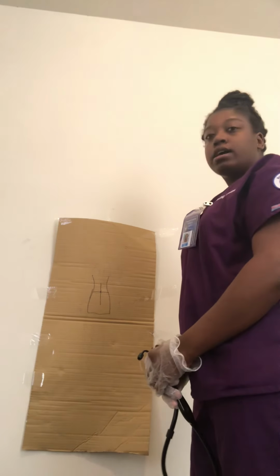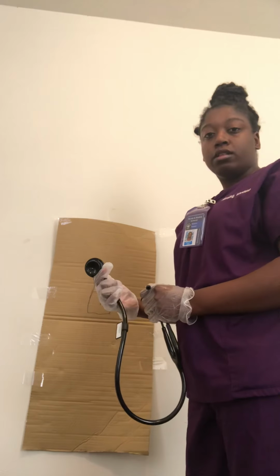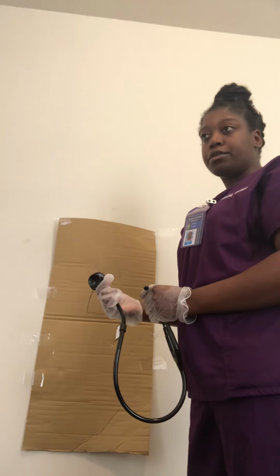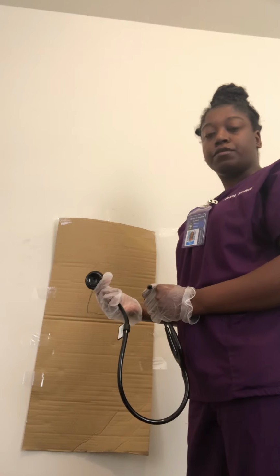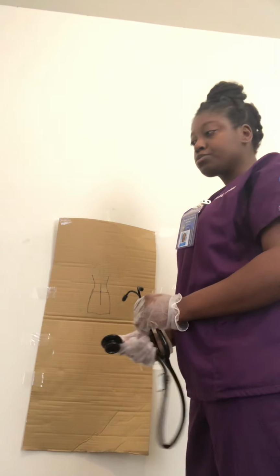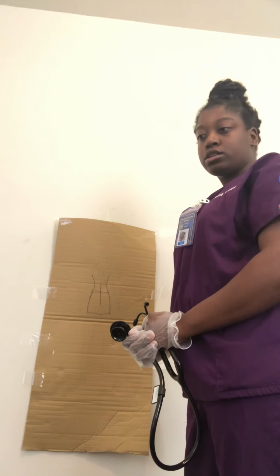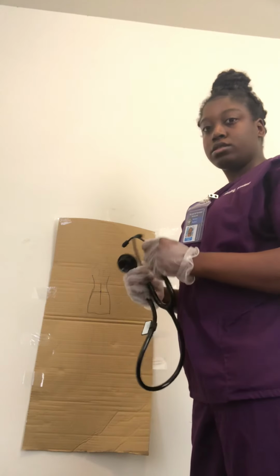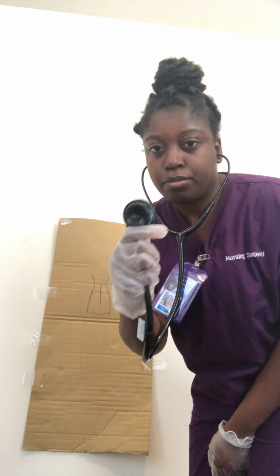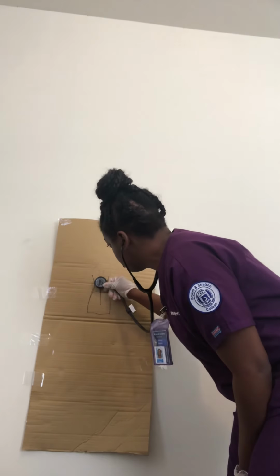Now I will auscultate using the bell of my stethoscope at the abdominal aorta, and I'm listening for bruits, and bruits is a turbulent blood flow. I will start at the xiphoid process down to the pubic symphysis, just 2 inches above the umbilicus. So I'm using the bell of my stethoscope. I'm starting at the xiphoid process.